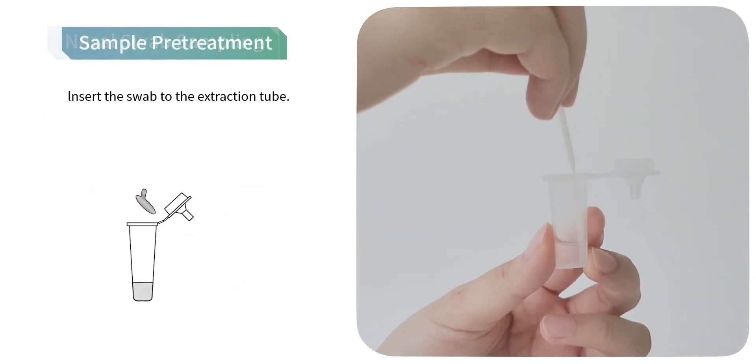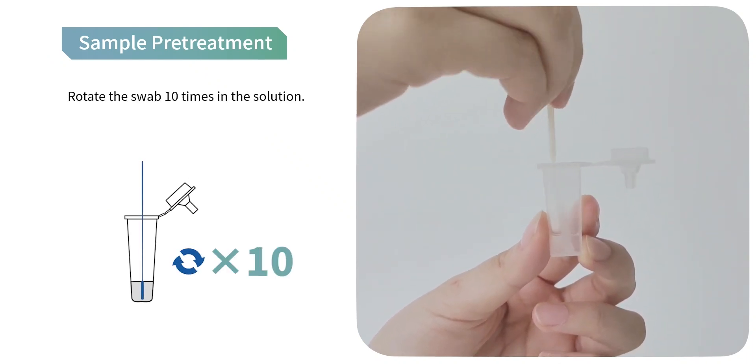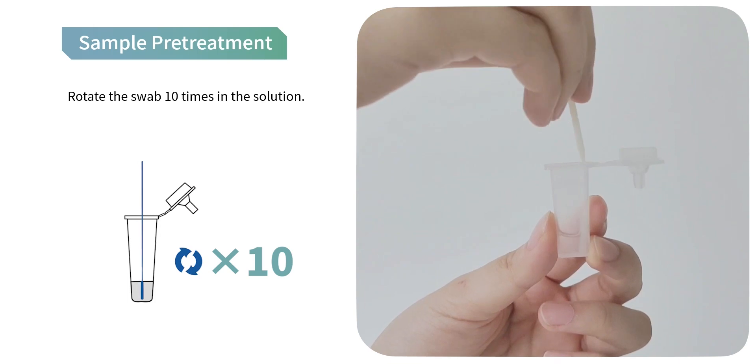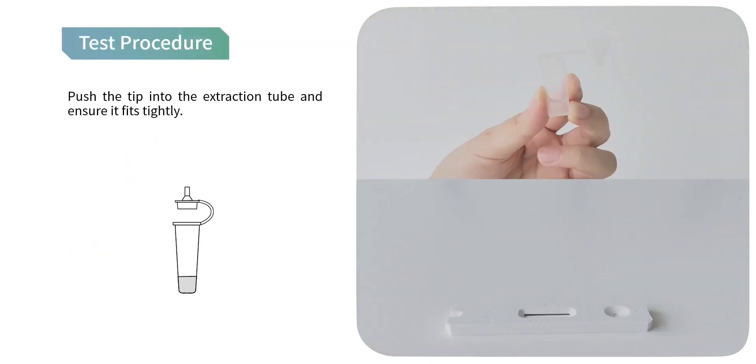Sample pretreatment: insert the swab into the extraction tube, rotate the swab 10 times in the solution, and squeeze the swab tip along the inner wall of the extraction tube 3 times.